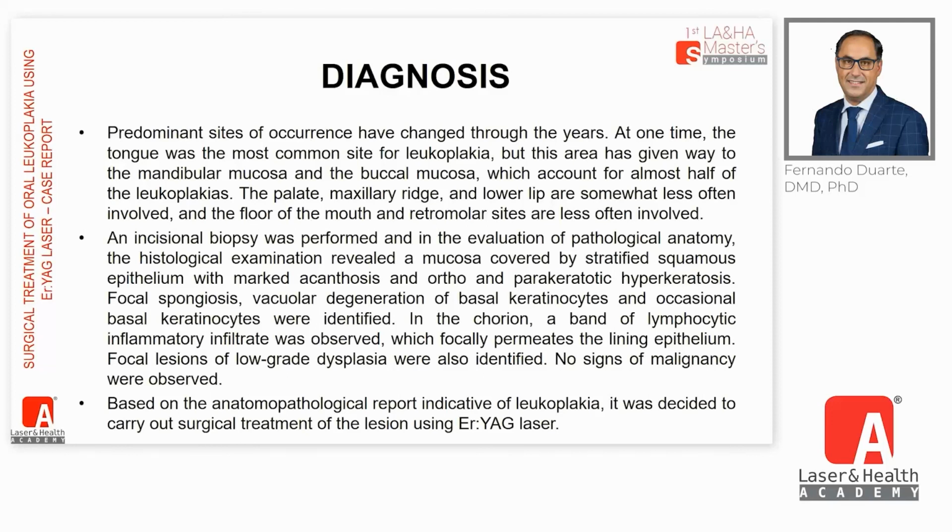In the chorion, a band of lymphocytic inflammatory infiltrate was observed, which focally permeates the lining epithelium. Focal lesions of low-grade dysplasia were also identified. No signs of malignancy were observed.